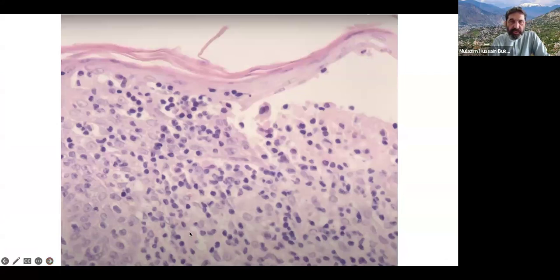Here you see one or two histiocytes. These are epithelioid cells. These are some other cells. So this can confuse histopathologists. This is a granuloma. Because histopathologists also try to escape, saying, just call it a granuloma and be done with it. So do not go like this. Take another history when you see the granuloma.